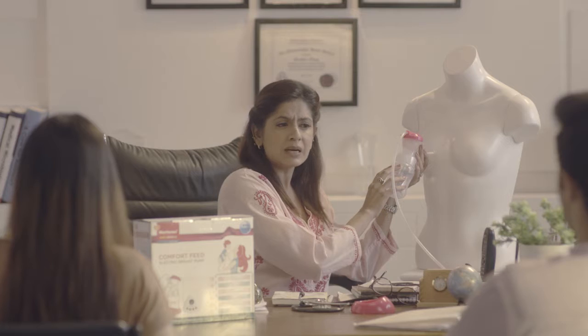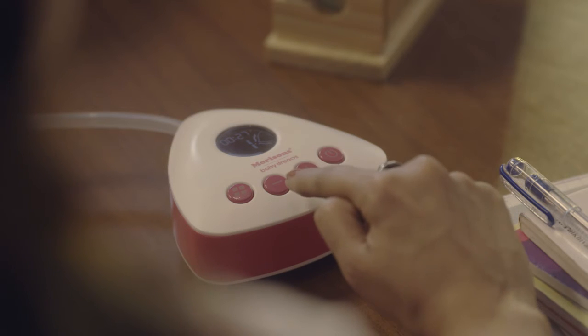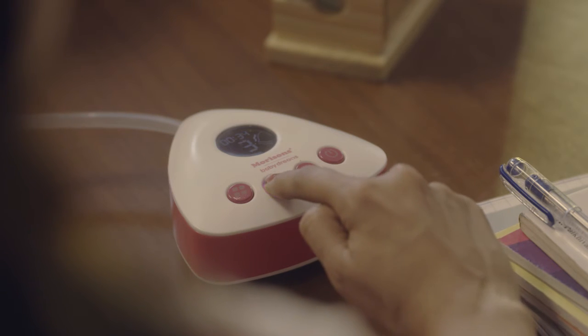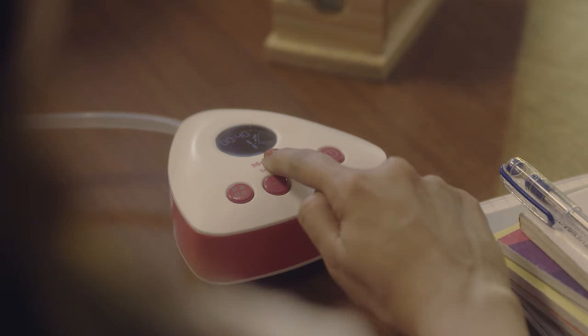For the first two minutes, do not expect the milk to come out — this is just warming the breast. This might take a little longer, but don't give up. You can change the level freely from 1 to 5 by pressing the plus button to increase and the minus button to decrease, and find your exact comfort grade, with grade one being the gentlest massage.